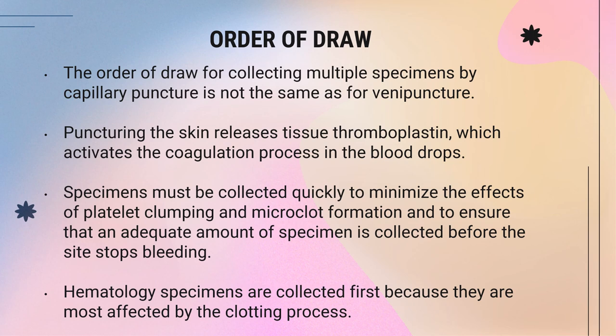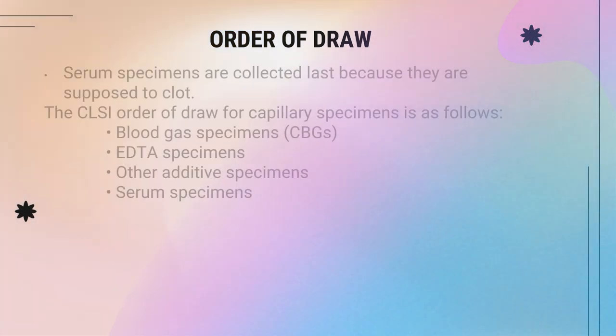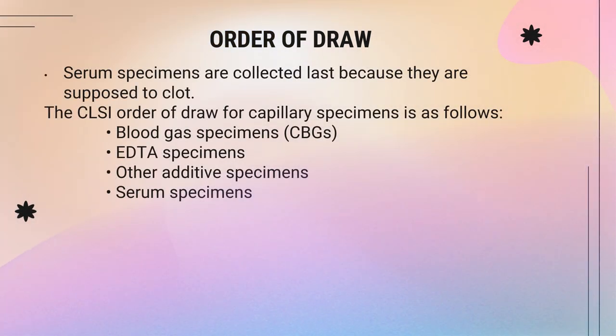So we have the coagulation tests for the hematology section. We have the prothrombin time and then the APTT, and then for CBCs, you have to collect it first to avoid platelet clumps. Serum specimens are collected last because they are supposed to clot.